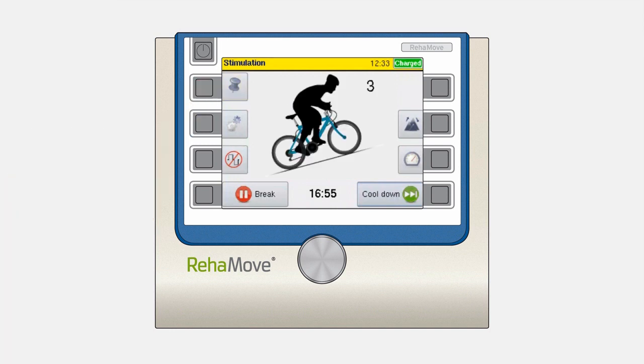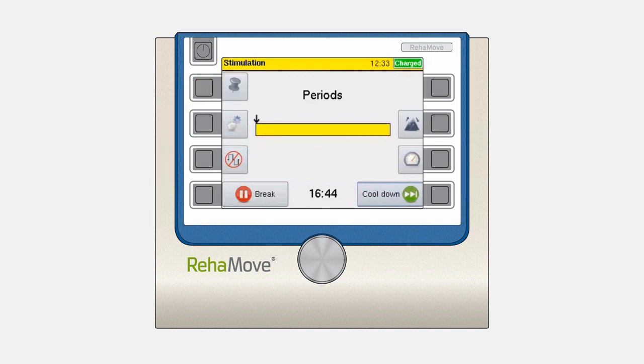If you press this button, it will pin this screen in place and you will see an arrow symbol. By pressing this button again, you will unpin the screen and are able to change the information displayed.